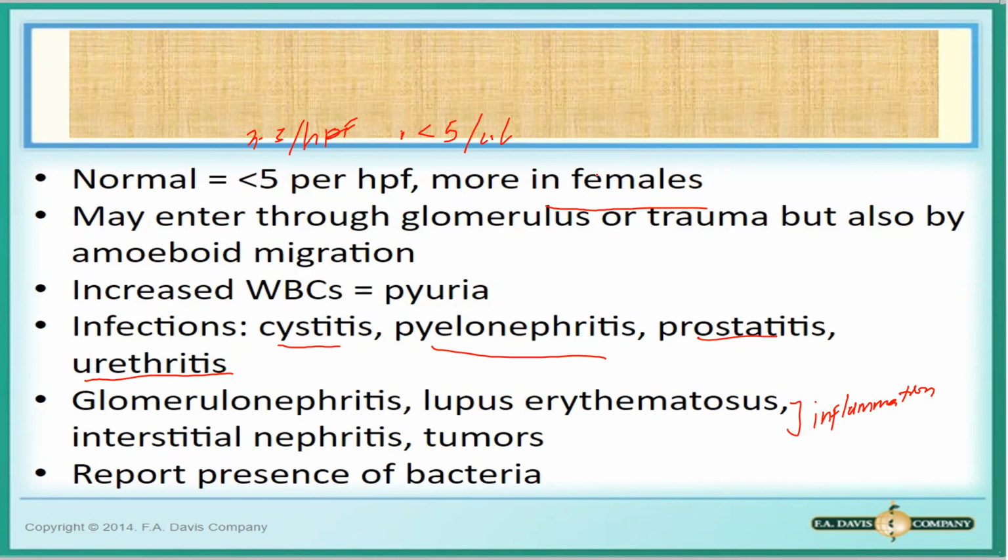That's why, mas maraming WBC ang babae kaysa sa lalaki. And of course, lalong-lalo na kung hindi nyo sinabihan na, again, midstream clean catch. Makikita mo maraming WBC, maraming epithelial cell, minsan may mucus pa. So, pag ganun, most probably, it's only contamination. Lalo na kung walang symptoms si patient.